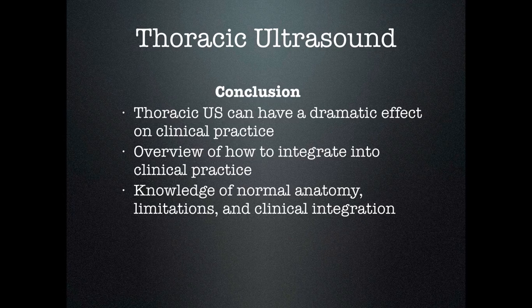So in conclusion, I hope you see that thoracic ultrasound can have a dramatic effect on your clinical practice. This was just an overview of how to integrate it into your clinical practice. Please remember that a lot of the information you read about thoracic ultrasound has problems, especially research articles. They have problems with how they're doing their systematic approach. Hopefully I've shown you a very easy systematic approach that will help you integrate this into your clinical practice.